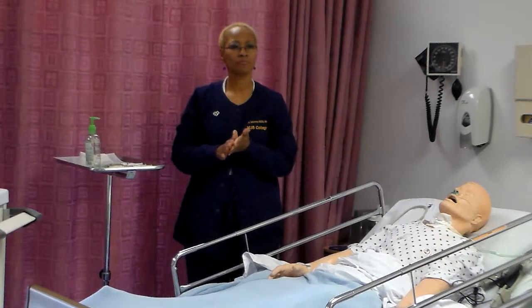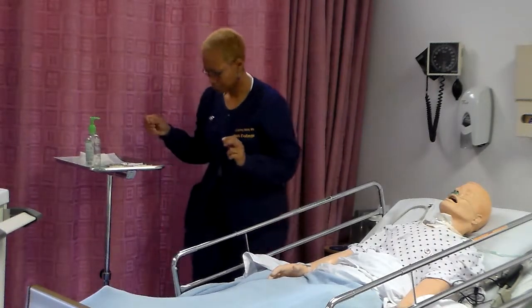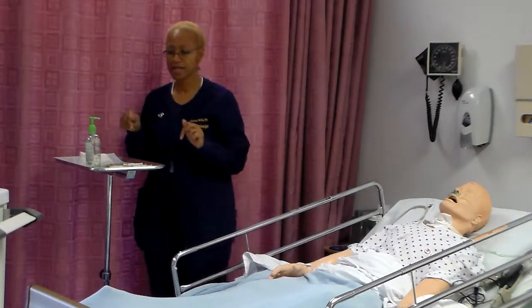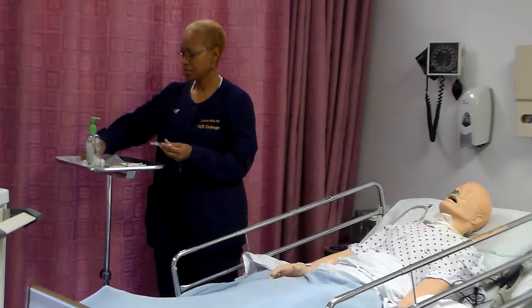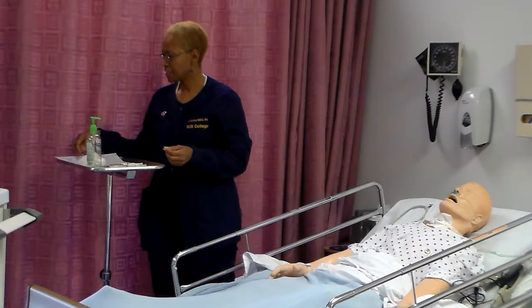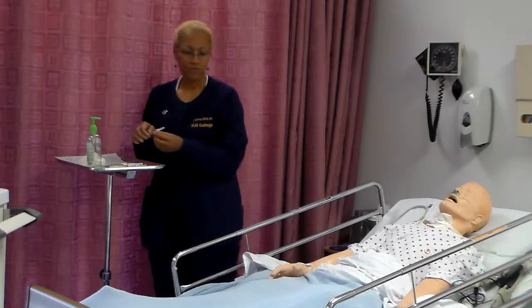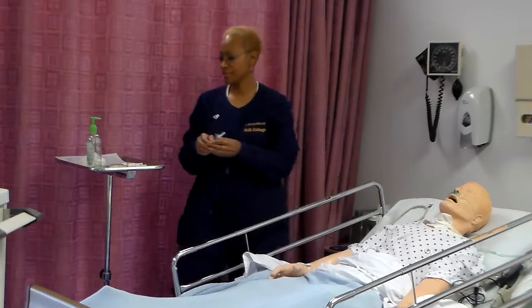Compare the label of the medication with the MAR one more time at the client's bedside. Third check. Okay, so I do my 3rd check at the bedside. And this is a time that you can educate him. If you like, you say, okay, I'm going to give you whatever the medication may be. You ask him if he's aware of the medication. He says, yes, I am. I get it all the time.